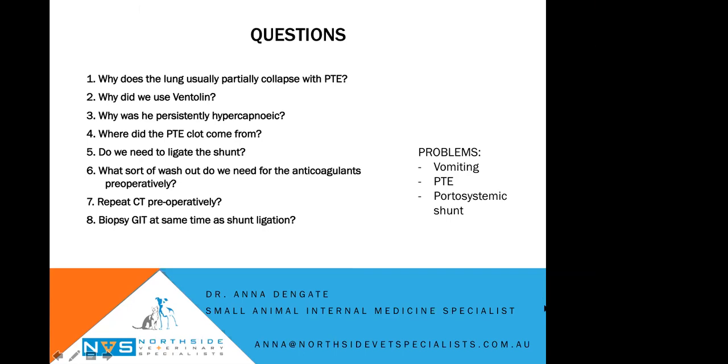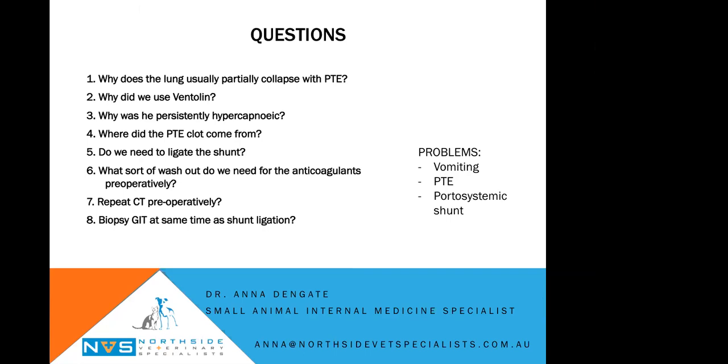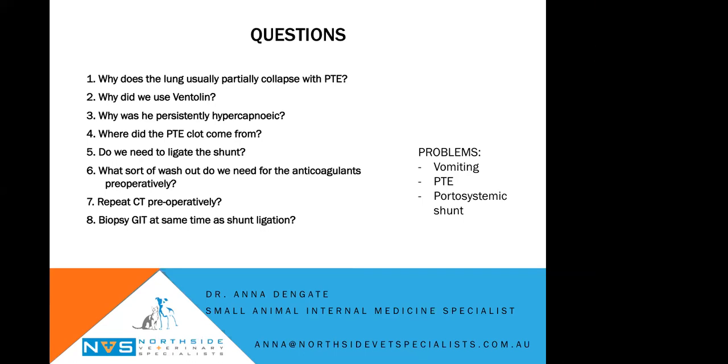Okay, awesome. And in your experience, would you do one on the anticoagulants and then one immediately preoperatively, just as a comparison? Yeah, usually with cats, we don't have a lot of experience with cats, but usually we don't see a huge difference in the normal TEG when we are doing it in patients on clopidogrel. You don't really see an effect on the normal TEG. What we could do is platelet mapping, so we can actually test the ADP receptor. But I guess just the normal TEG would probably be sufficient in that case, because that gives you more of an idea what's happening in the cat overall, holistically assessing the clopidogrel effects. Yeah.